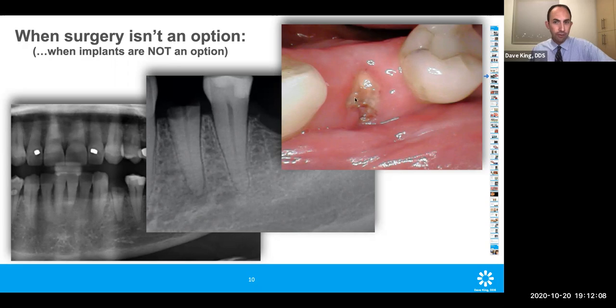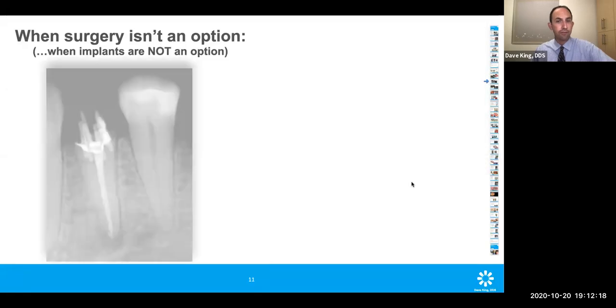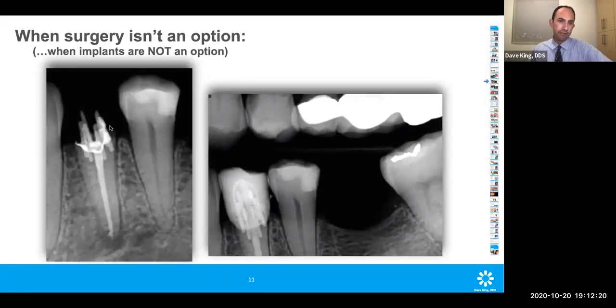So we opted to do our best to save the tooth and even restore it, rather than just taking the decay out, completing an endo, sealing it at the gum line, and looking at a partial denture. We opted to try to restore it back to full function. So here's what we did. I put in 6 titanium pins after the endo, and this is a Cerasmart. It's a hybrid resin ceramic restoration. Put in a crown. This is a couple of years ago.